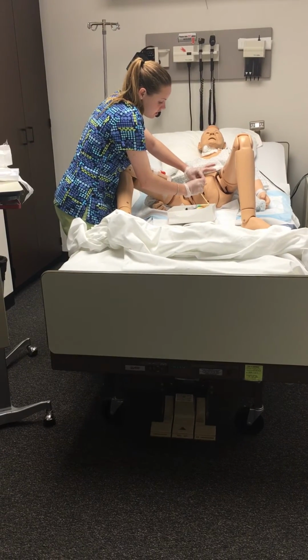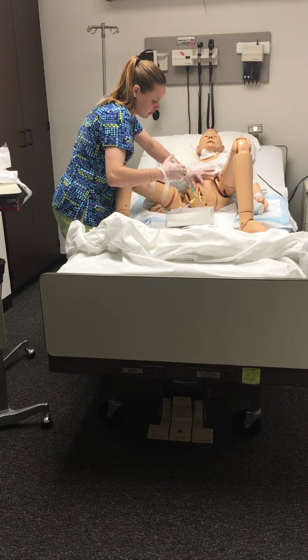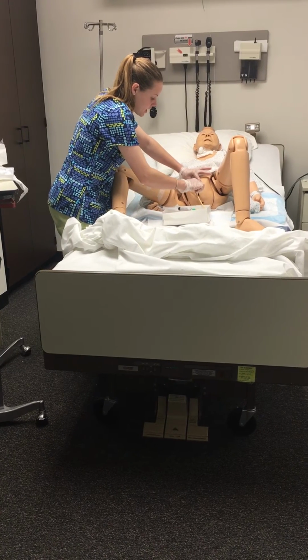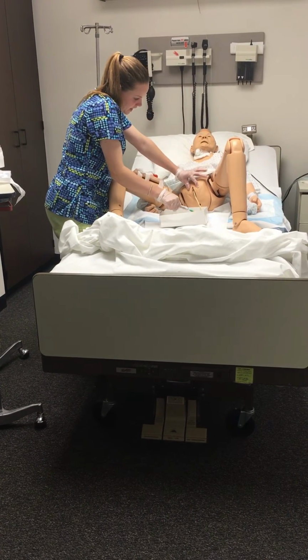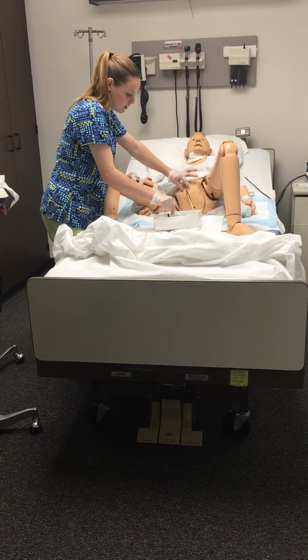And then I would insert the water all the way to 10 for this one, and then I would pull a little bit, and since I saw that it stopped, I would push it back in a little bit. And I wouldn't force it in if it didn't go. And this is still my dirty hand.